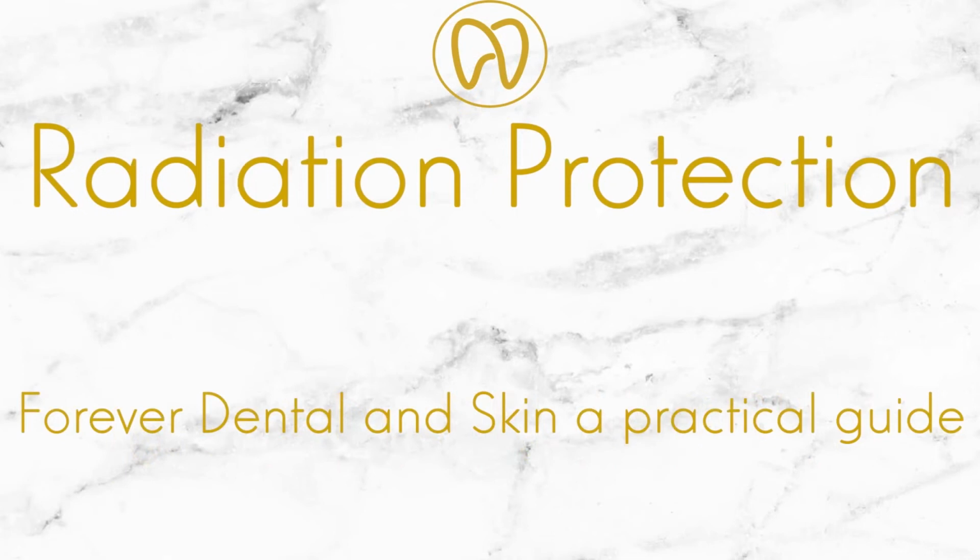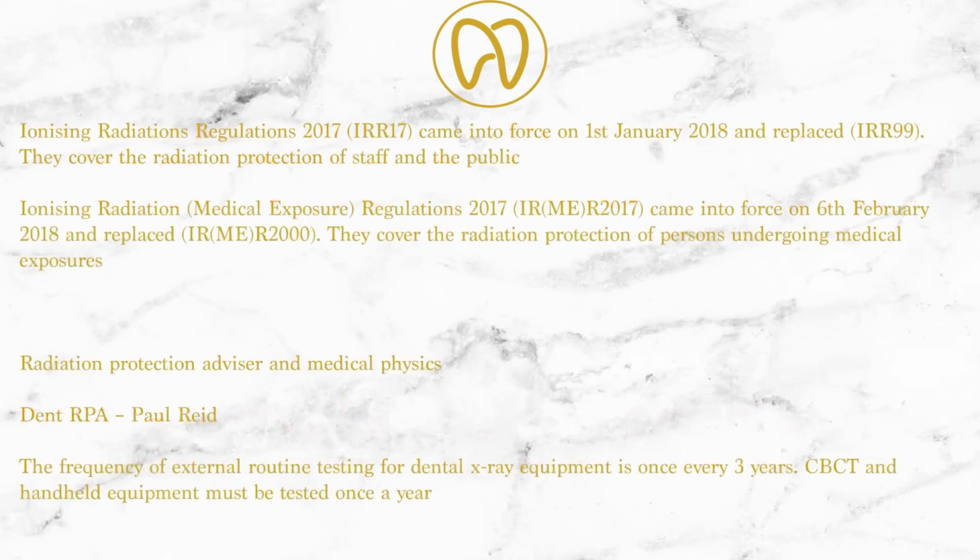Radiation Protection at Forever Dental and Skin, a practical guide. Radiation protection is a very important subject within a dental practice. We have key responsibilities to protect the patients and protect ourselves when using ionizing radiation.